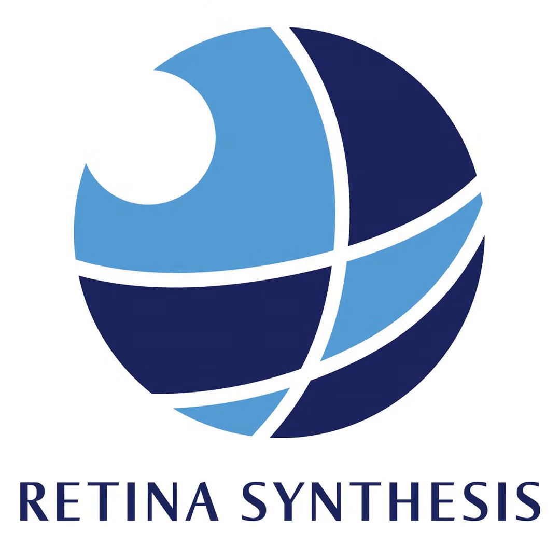There are some devices that have peripheral line scan capabilities for OCT. You can move a line scan. It's not really OCTA yet, but I think it's starting to get there in the far periphery. But right now, you can get to the mid periphery or even a little bit farther, just doing some montages.